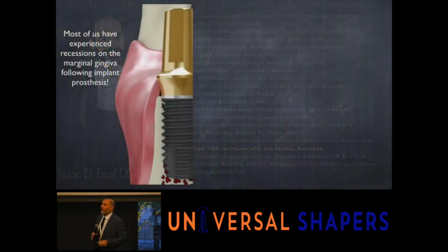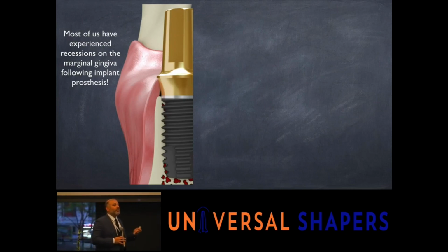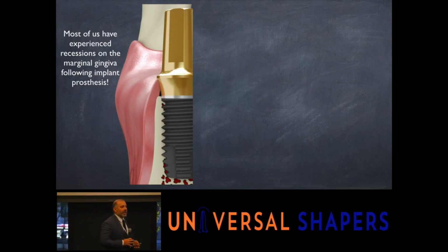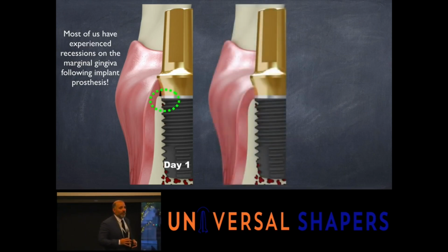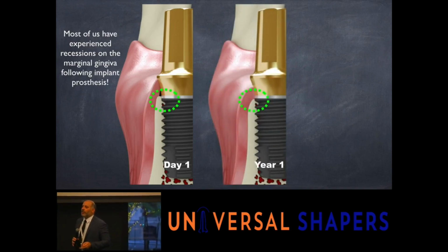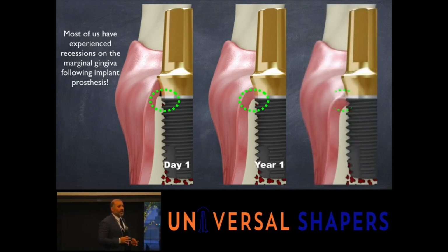So most of us have experienced recession over the years. We have placed an implant. We have a simple solution to do that. We create an osteotomy. We allow it to heal. We put an abutment. We put a crown. And then over time, from day one when we insert the abutment, something keeps happening. Something biologically keeps occurring. And we may see some recession, some bone loss, some gingival recession, and that may lead to some aesthetic failures. It may lead to some peri-implantitis.